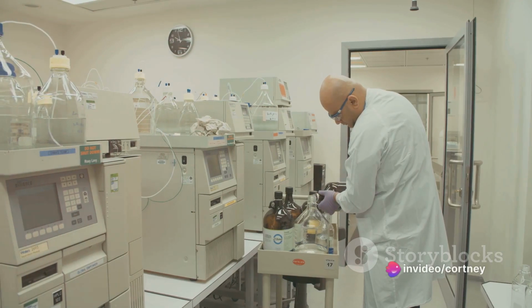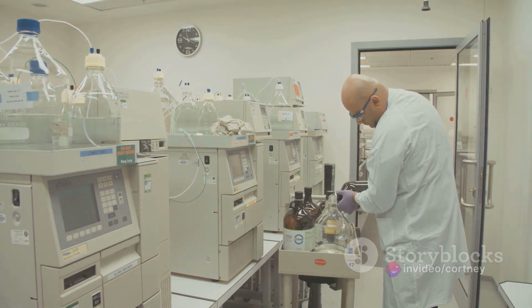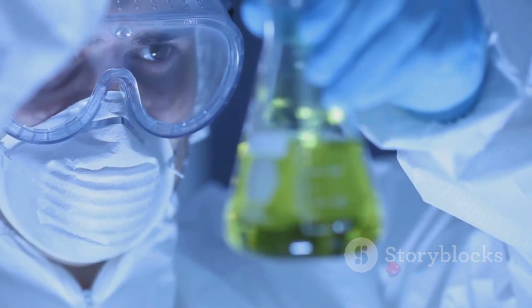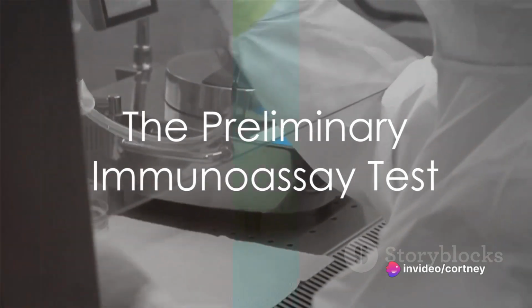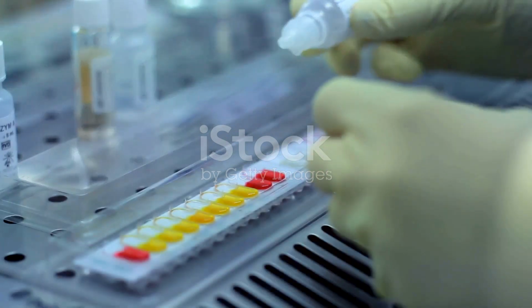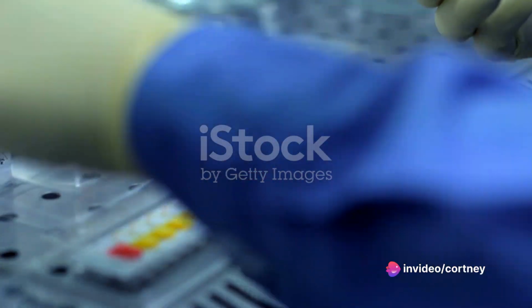It begins with a preliminary immunoassay test, a quick screening method, followed by gas chromatography, a more specific and precise technique. So, let's dive into the journey of a sample, starting with the preliminary immunoassay test. The first step in the drug testing process is the preliminary immunoassay test. This test utilizes the interaction between an antibody and its corresponding antigen or target. The immunoassay test measures the presence of drugs in a sample by observing this reaction.